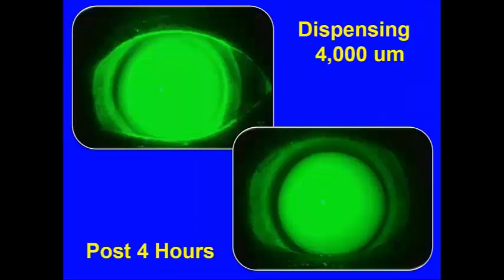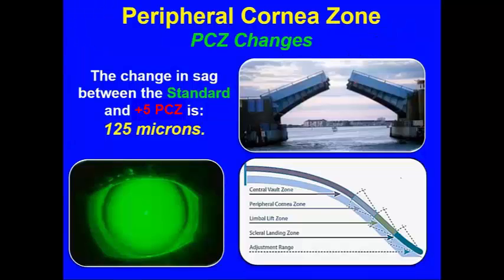It's important to remember that if you see that amount of dark fluorescein thinning immediately upon applying the contact lens, it's important we understand that this lens is only going to settle in further throughout the day, and that amount of peripheral corneal thinning or peripheral tear thinning is going to dramatically increase. It never gets better, it only gets worse. So when we see that amount of fluorescein thinning in the periphery, we know immediately that we need to make a lens adjustment.